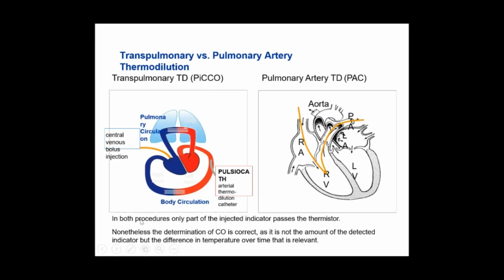Right? But always remember, if you are going for an absolute value of cardiac output, it is always the PA catheter which will give you the more accurate value. For the accuracy of one isolated value of cardiac output, you have to depend on the PA catheter. If you go for this technique, the one isolated value may not be very accurate.